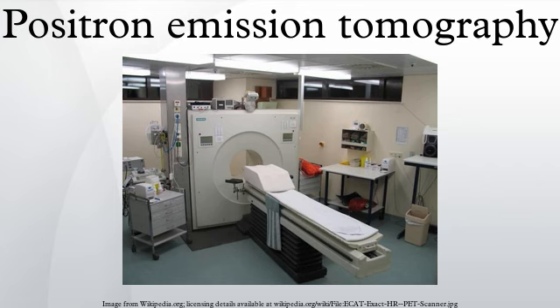2D/3D reconstruction. Early PET scanners had only a single ring of detectors, hence the acquisition of data and subsequent reconstruction was restricted to a single transverse plane. More modern scanners now include multiple rings, essentially forming a cylinder of detectors. There are two approaches to reconstructing data from such a scanner. 1. Treat each ring as a separate entity, so that only coincidences within a ring are detected. The image from each ring can then be reconstructed individually. Or 2. Allow coincidences to be detected between rings as well as within rings, then reconstruct the entire volume together.